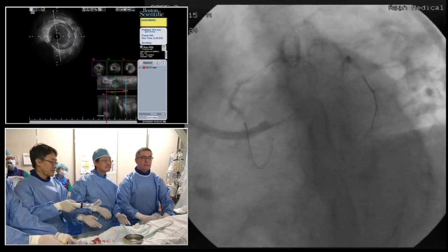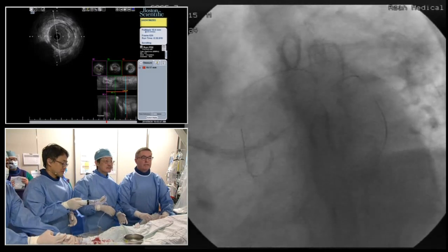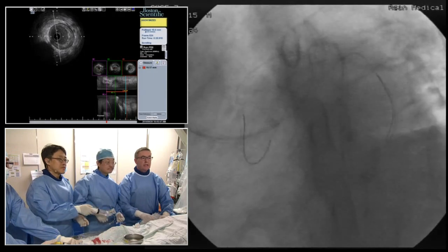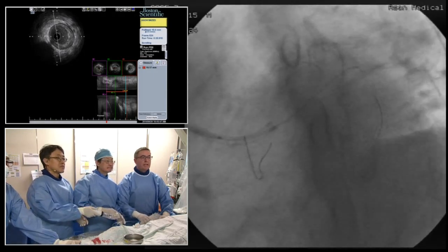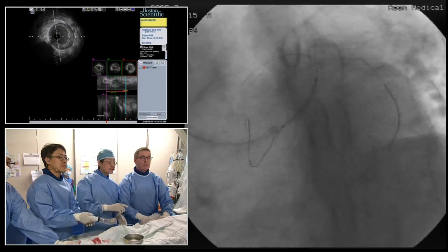And so, I'll just push him up now there. Yeah, that'll be all right. And you notice we've kept the distal end of all 3 wires from buckling in case we need to exchange those. So in these techniques where you do wire exchanges in these procedures, I like to try and keep the wires from buckling.